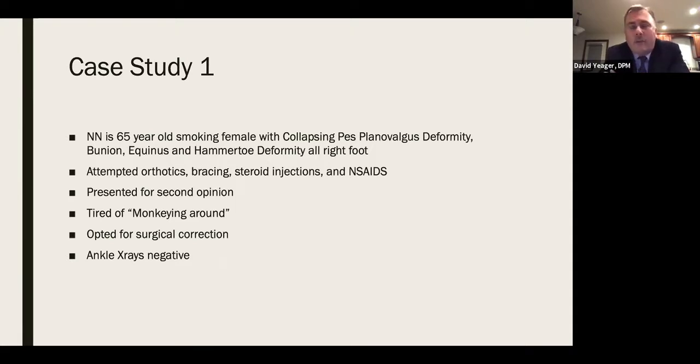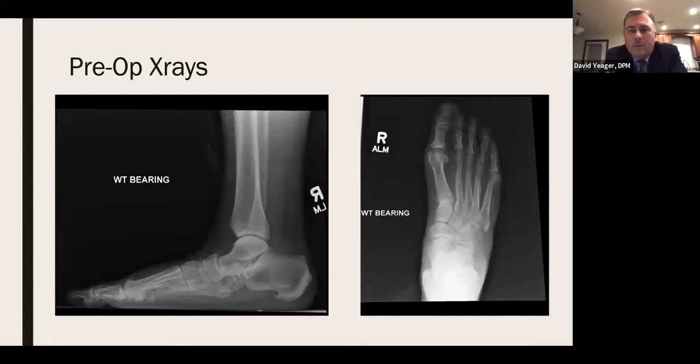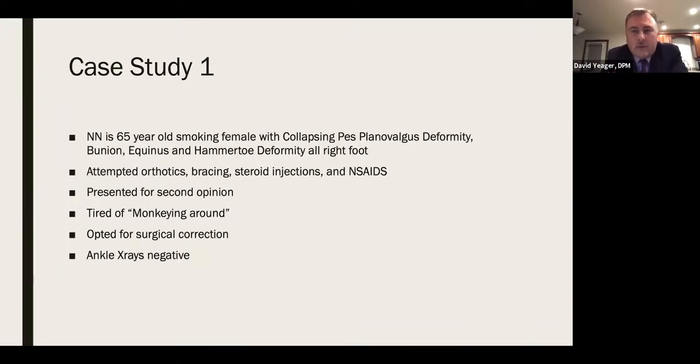And really, if I could stress one thing this evening, it's that it's a product that you want to use on your patients if you think that they're smokers, because they all lie, okay? If you think that they're diabetic, if you think that there's something that is going to prevent you from getting and healing what you want and where you want to end with the patient. And so, in a nutshell, the three cases that I have this evening, and I'd like to just jump into them, are cases that, number one, are failures, or number two, patients that I think are not going to heal. So we can go back one slide there real fast. I'm sorry, Paul.